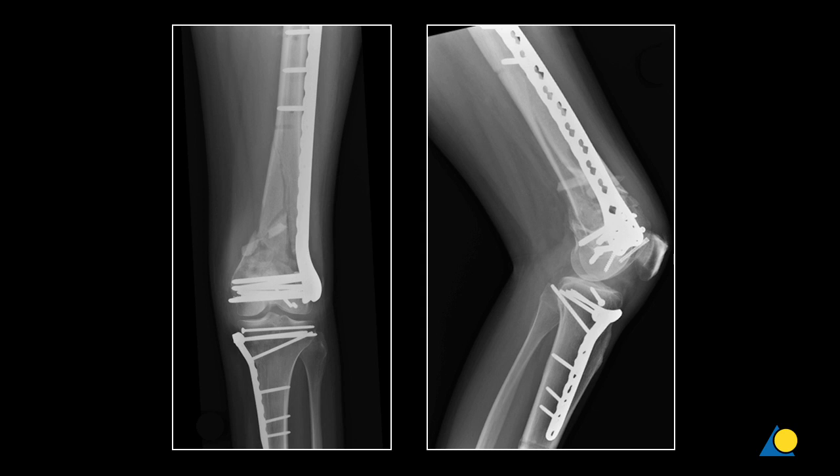Variable angle locking screws were inserted in the distal portion of the plate in order to gain purchase in all articular bone fragments. By directing variable angle screw placement between the interfragmentary articular screws, all distal screw options in the plate were successfully utilized, providing maximum possible fixation in the articular block.